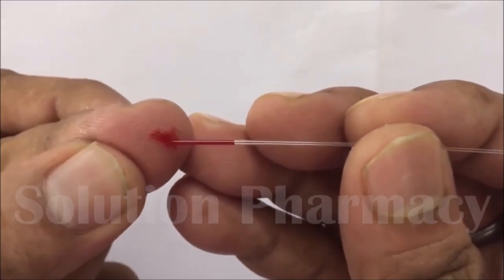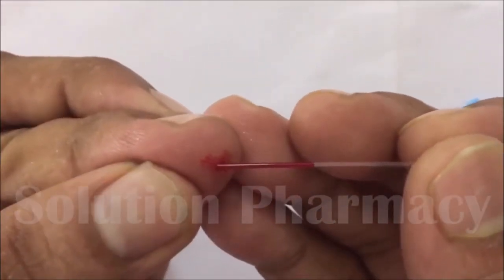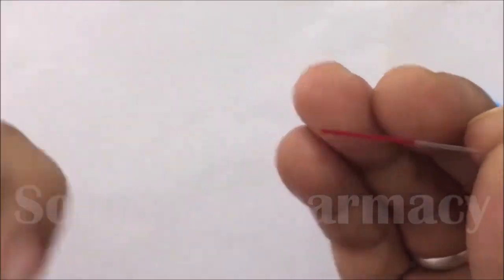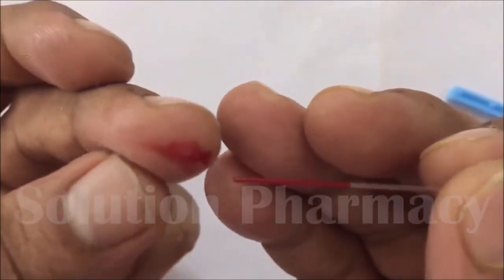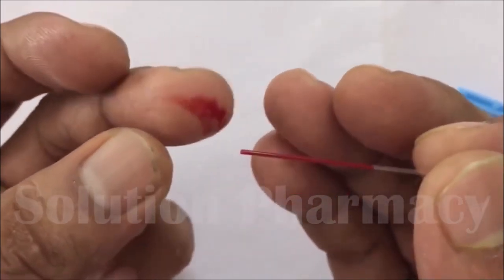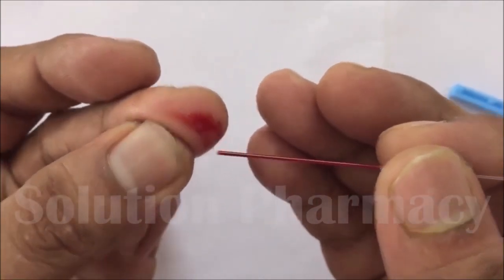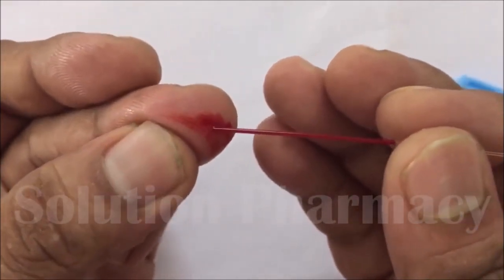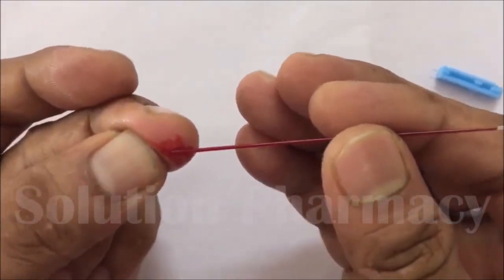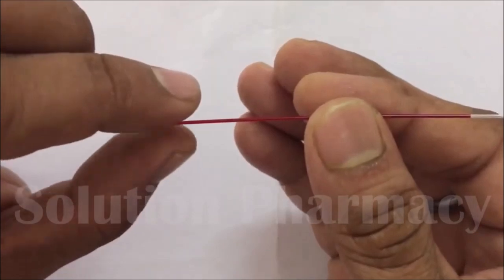For this, dip one end of the capillary tube in the blood and the blood will rise up into the capillary tube by capillary action. You can clearly see here how the blood rises in the capillary tube when we touch the tip of the capillary tube into the blood. You have to start the stopwatch and note the time when the blood starts to enter the capillary tube. After filling the capillary tube with the blood, wait for 30 seconds. Here we have fast forwarded the video.